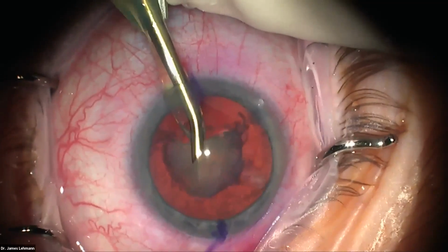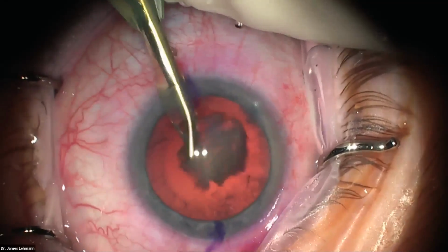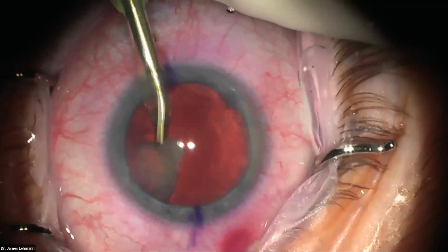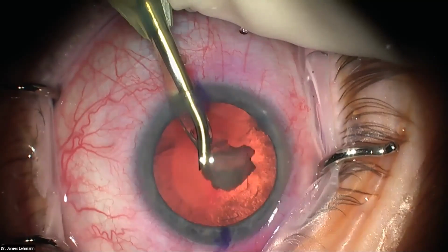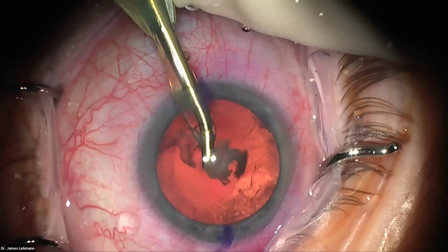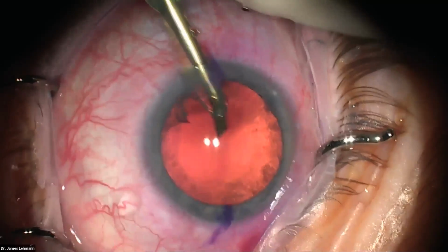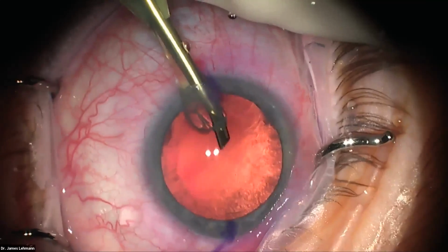And again, moderate power, and I don't really need to be protecting my capsule as long as I'm up high and I don't have that phaco tip pointed inferiorly. See, it's just bouncing on the tip there. Everything's going fine. Just taking my time, being patient. Okay. Now there's some little stray fragments floating around.